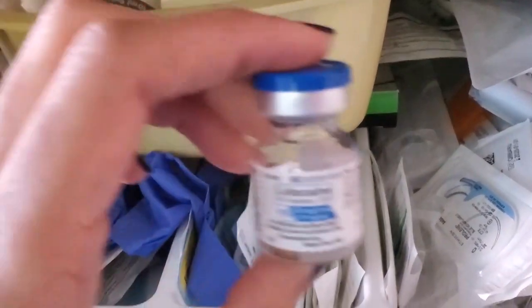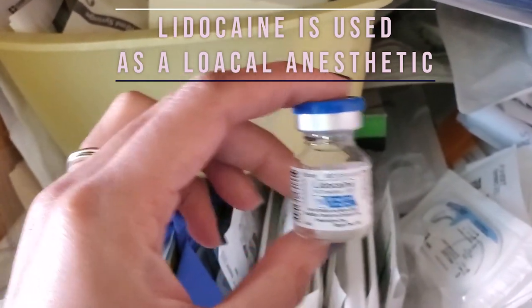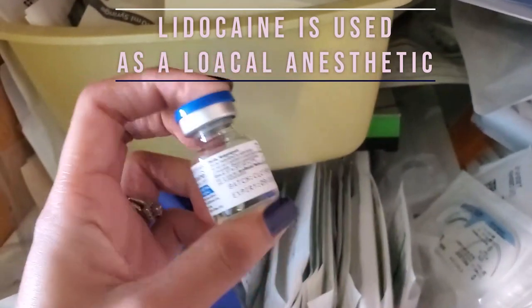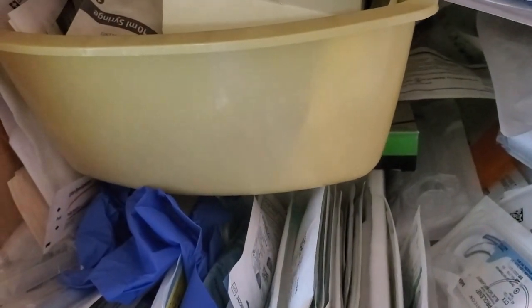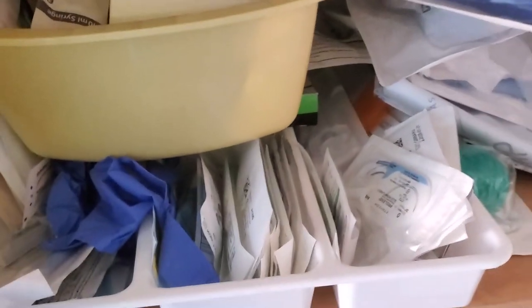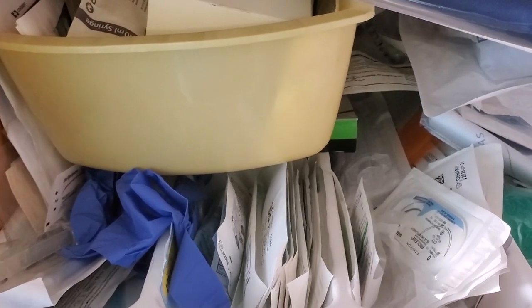We always keep the lidocaine that we get from some of these different kits that we don't use, because we use lidocaine for a lot of things. So this is lidocaine 1%. You'll put that in to really ensure that the patient is anesthetized right and they'll be able to tolerate the procedure. But I want to show you guys these sutures. So I'm going to take out some sutures and talk about those for you.